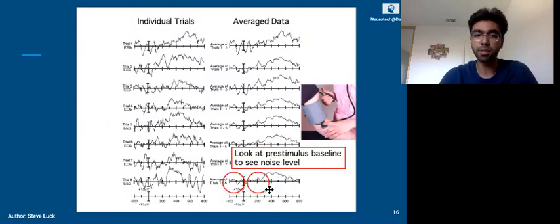To someone who isn't familiar with this data, in the last waveform where you see these circles, it might even look like, what is that? That doesn't look like a distinctive pattern or a waveform at all. And that's part of just having experience with it. But if you use machine learning models to train it, they're better at detecting patterns and detecting the intensity and the differences between the stimulus presentation and baseline recording. And so that would help in detecting patterns like that.